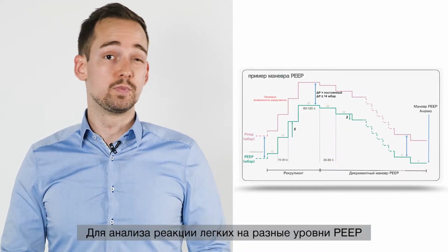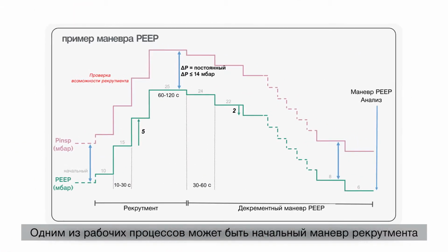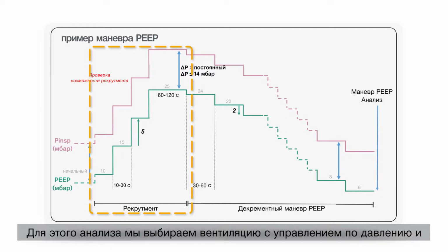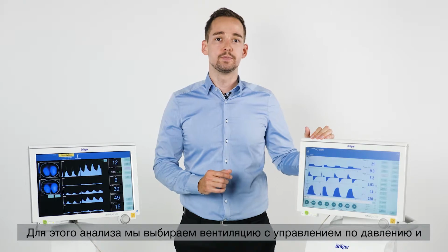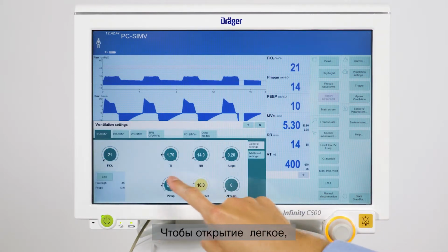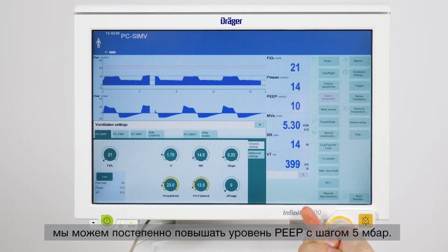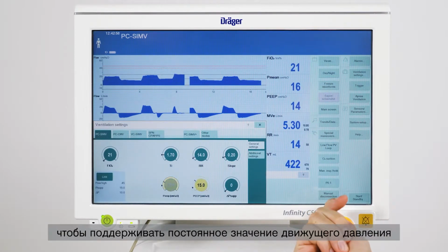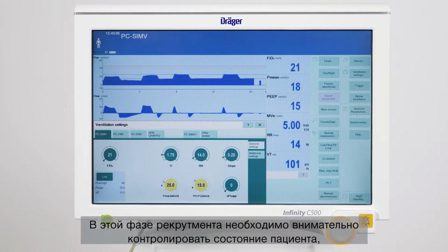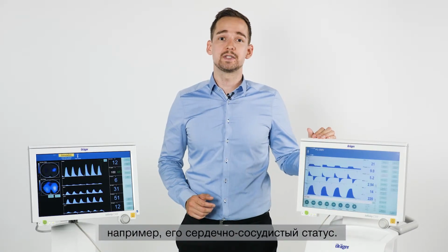In order to assess the lung's response to different PEEP levels, we need to perform a PEEP trial. One possible workflow could be an initial recruitment maneuver followed by a decremental PEEP trial. For this analysis, we choose pressure-controlled ventilation and use the function pressure link and quickset. In order to gradually open the lung, we can stepwise increase the PEEP level in steps of 5 millibar. We can use pressure link and quickset to keep a constant driving pressure and apply the increased PEEP levels immediately. During this recruitment phase, we have to closely monitor the patient's condition, for instance, the patient's cardiovascular status.